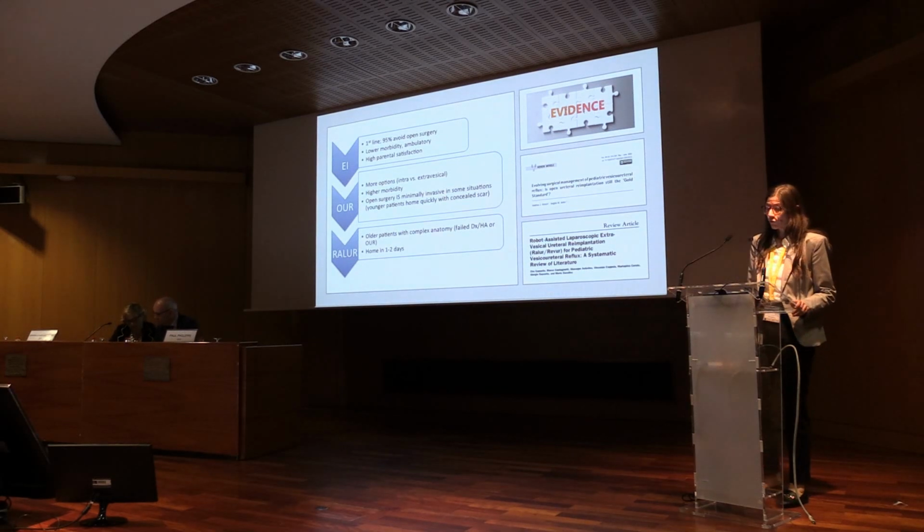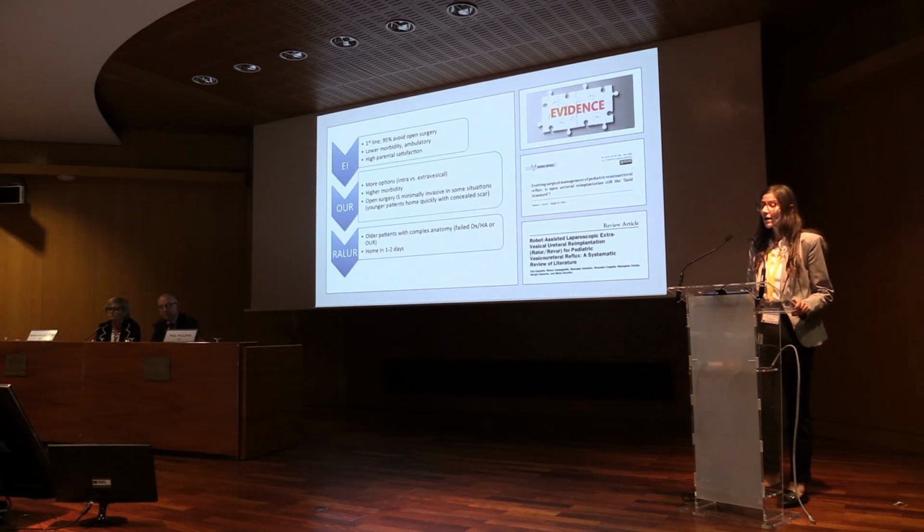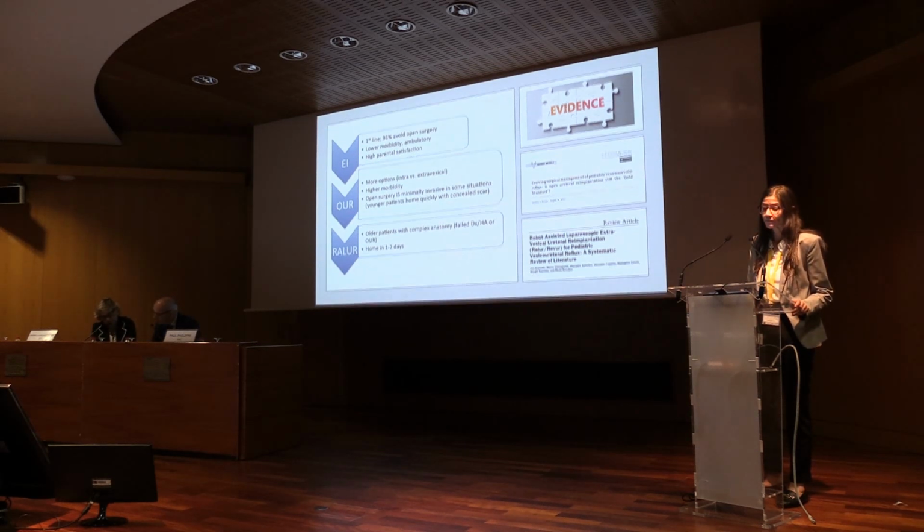Over the last few years, robot-assisted extravesical ureteral reimplantation has emerged as a valid minimally invasive alternative to conventional laparoscopy or open surgery. But further evidence is needed to establish it as the gold standard for surgical management of pediatric vesicoureteric reflux, especially in patients with complex ureter anatomy.